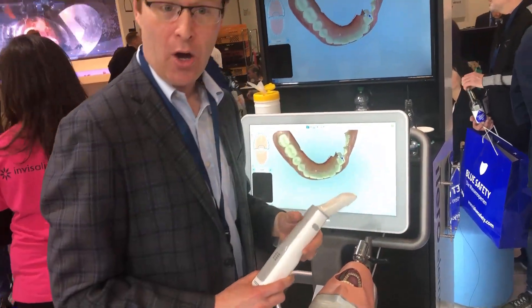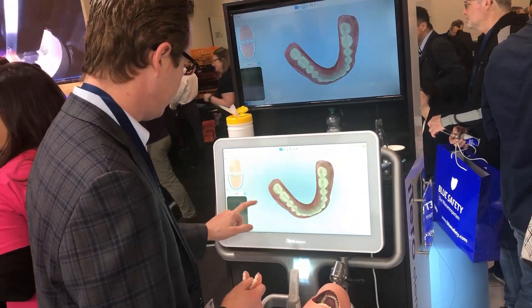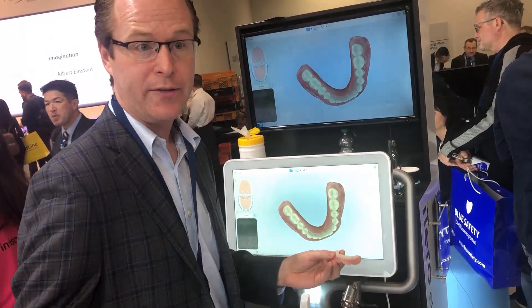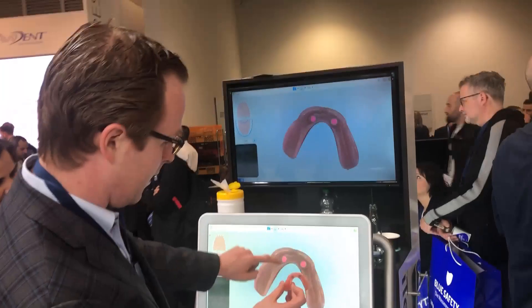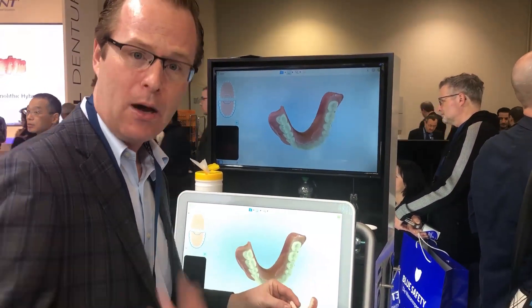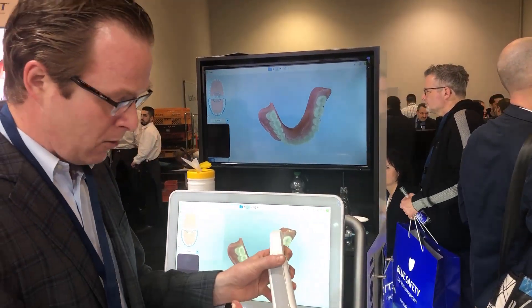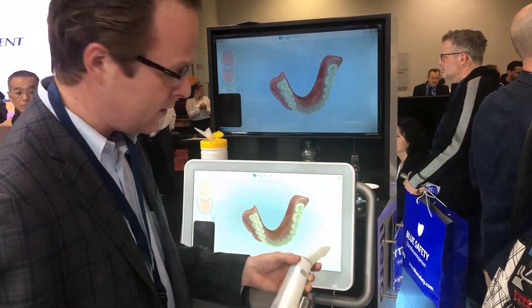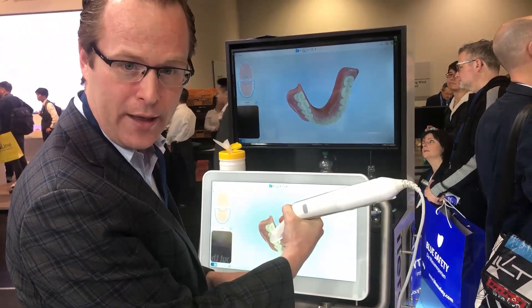Okay, so I gave it a go, and I think unfortunately I overheated it. In fairness to the iTero 5D, which is a very impressive scanner, I was able to complete an earlier scan 360 degrees completely all the way around — the computer algorithms allow us to do that. But there was a little challenge there: I was supposed to leave this air vent exposed. I probably had it covered with my hand and overheated the scanner, which is hence why we're supposed to hold it that specific way.